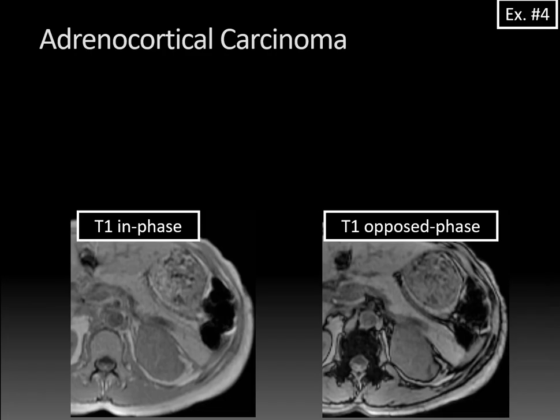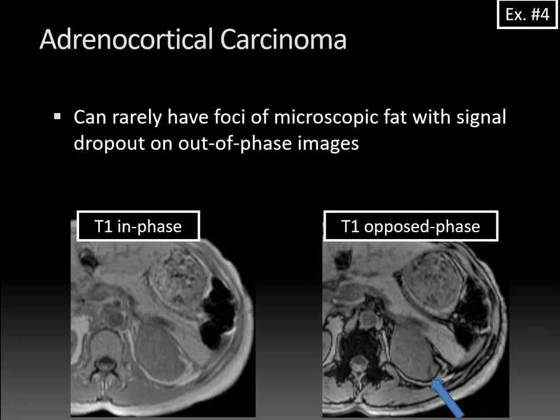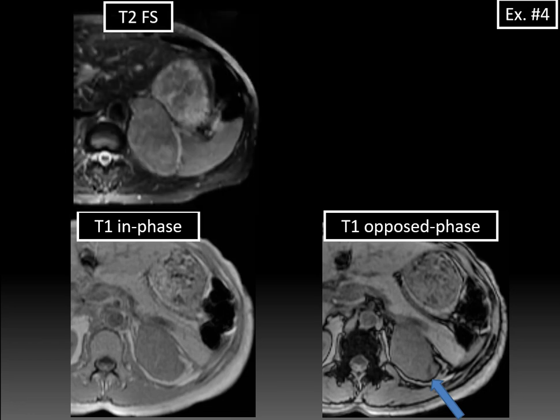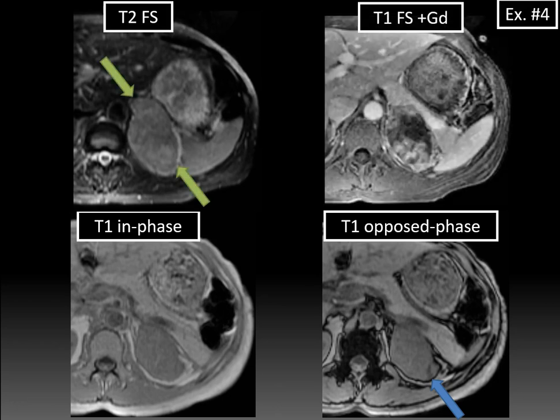Here's yet another left-sided adrenocortical carcinoma. On the opposed-phase image, there's a small area of signal dropout indicating the presence of microscopic or intracytoplasmic fat — and signal dropout throughout the adjacent vertebral body, which is normal and physiologic. Be aware that ACC can rarely have foci of microscopic fat with signal dropout on out-of-phase images, but don't confuse this small area of dropout with an adrenal adenoma. The remaining images show a heterogeneous, solid T2 appearance and heterogeneously enhancing, vascular post-contrast appearance — not consistent with adrenal adenoma. Even though ACC tends to present at large size, it starts small and could conceivably be confused with adrenal adenoma if caught at an early stage.